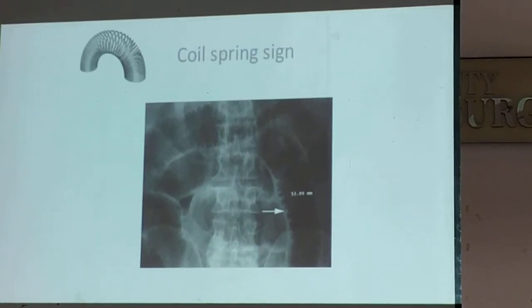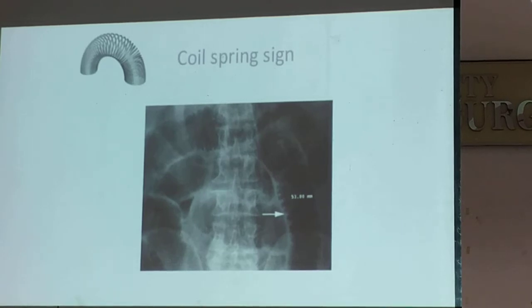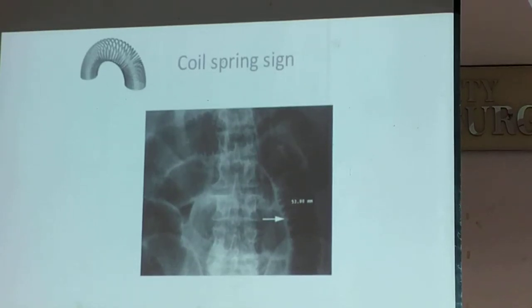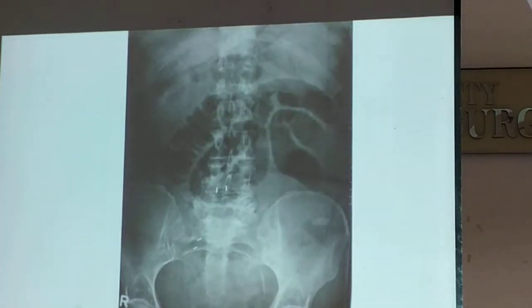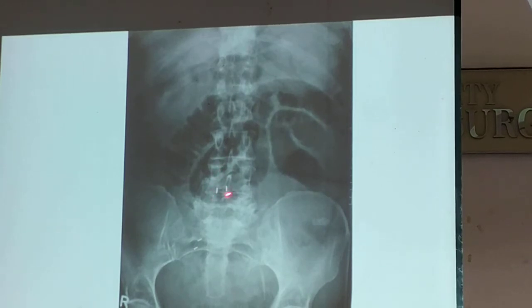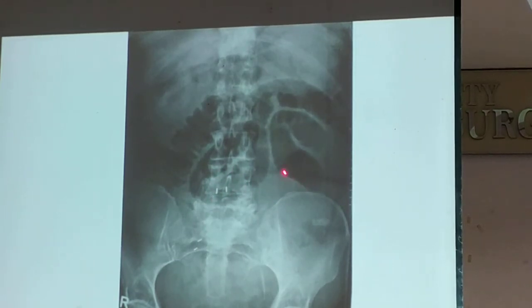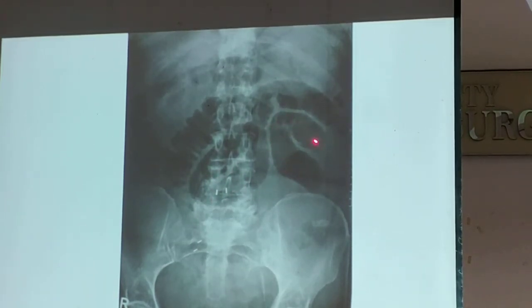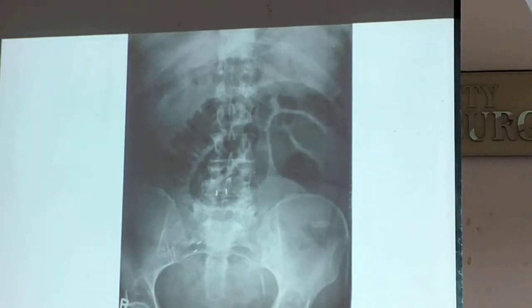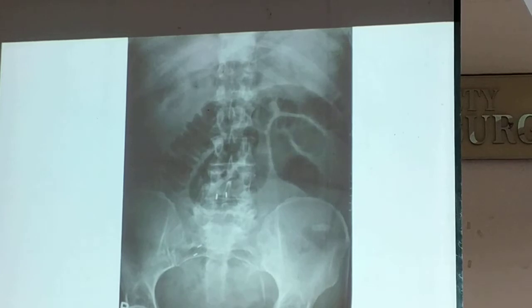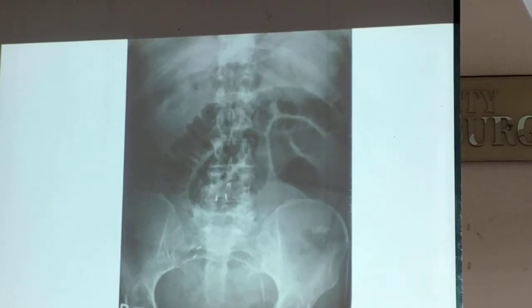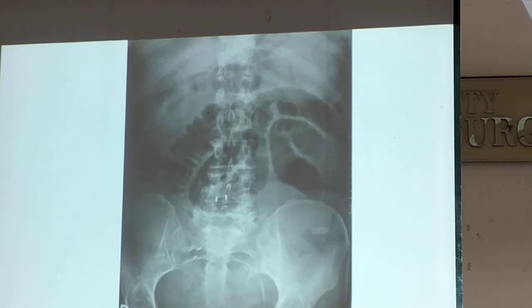That is the typical coil spring sign, seen in small bowel obstruction. This one you could say is the sentinel loop — it is an inverted U-shape. But as I said, this is not pancreatitis. You would observe the coil spring sign here.